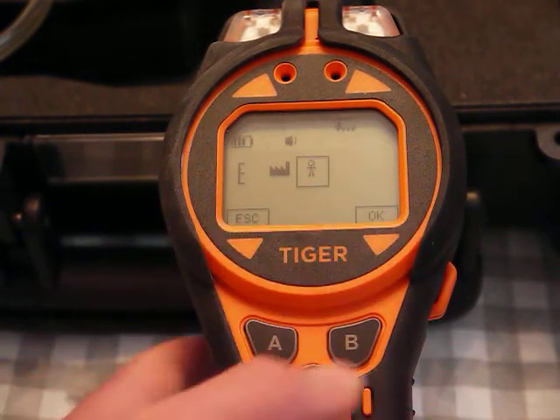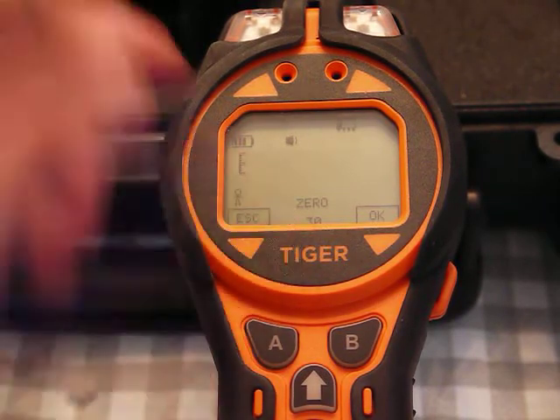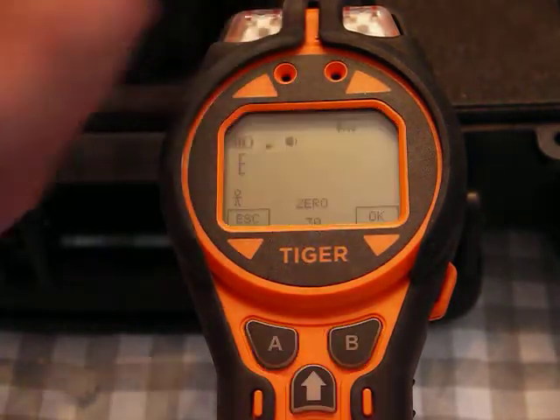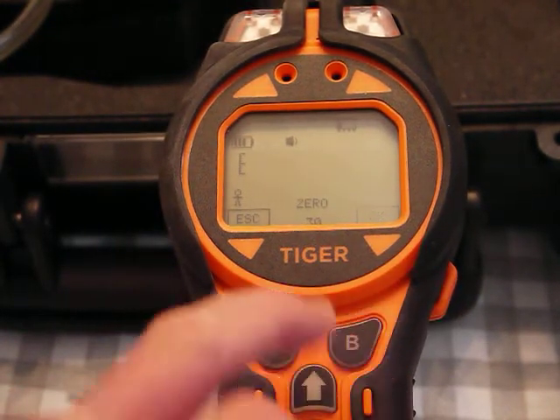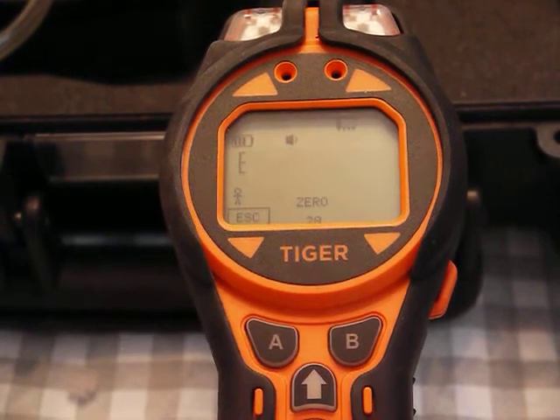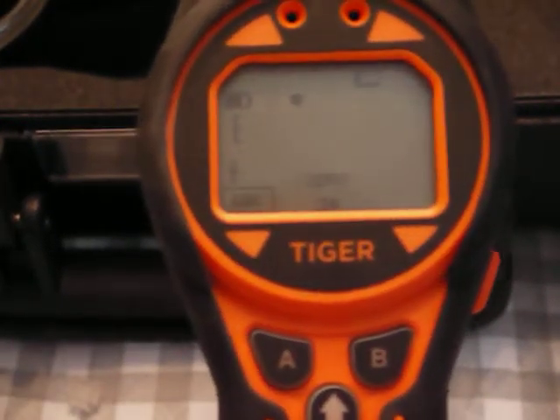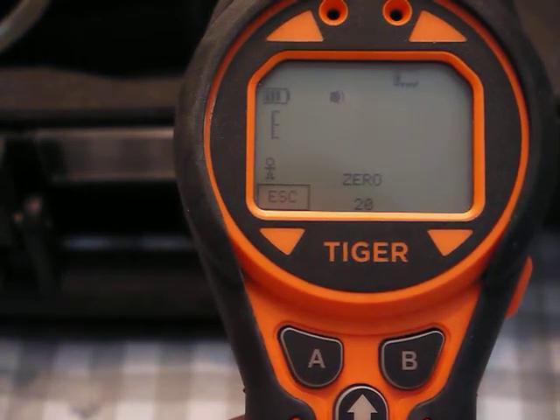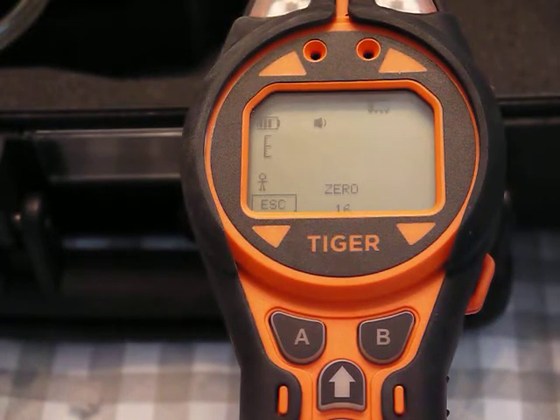It goes into calibration. There's a factory calibration or a calibration done by a person — I highlight that and hit okay. Now it's going to zero. The carbon filter is on and it gives me a 30-second countdown. I click okay and watch that 30-second countdown start going down as it tries to get a good zero reading through the filter.